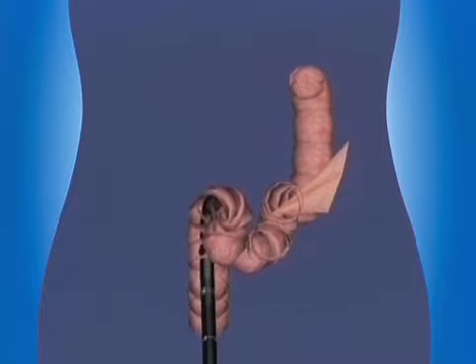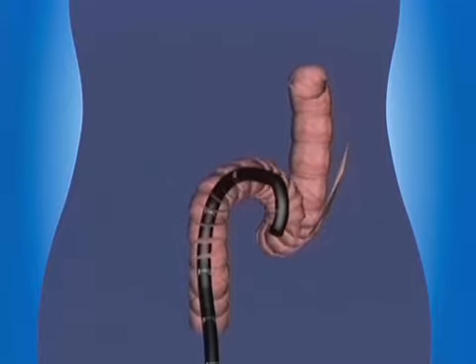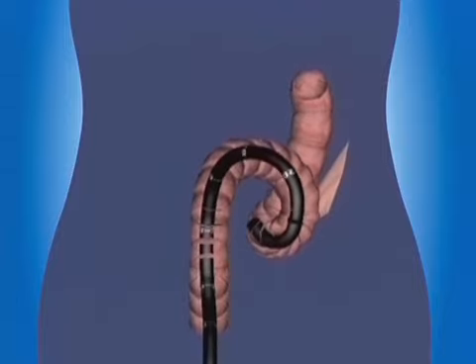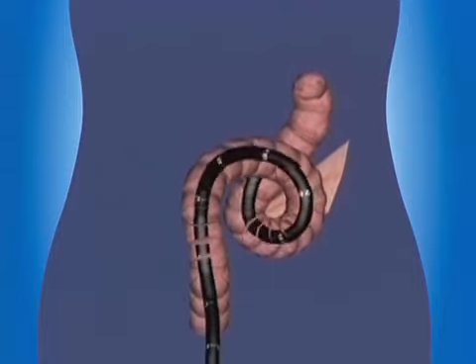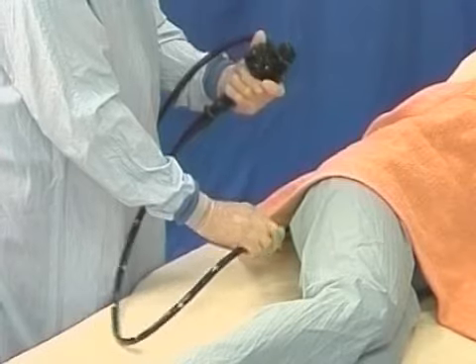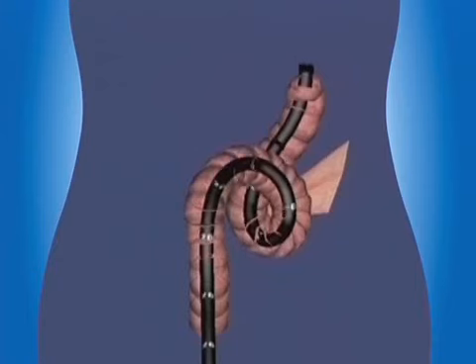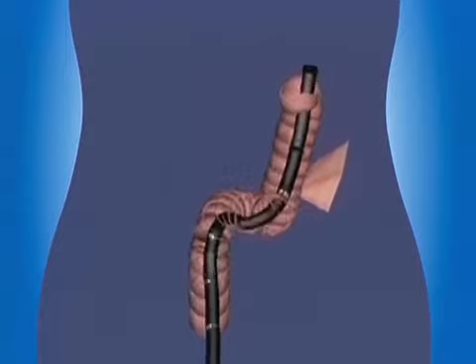If, on pushing in, the instrument becomes hard to handle, an atypical loop may be forming. Here, it's because the descending colon is mobile on a descending mesocolon, which allows the tip to push the colon across medially, and this then requires some finger skill dexterity to keep the luminal view as the shaft is pulled back and straightened.